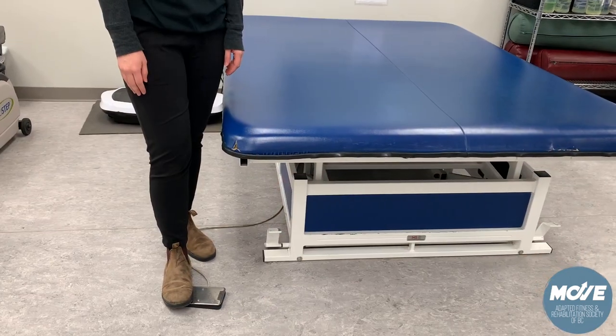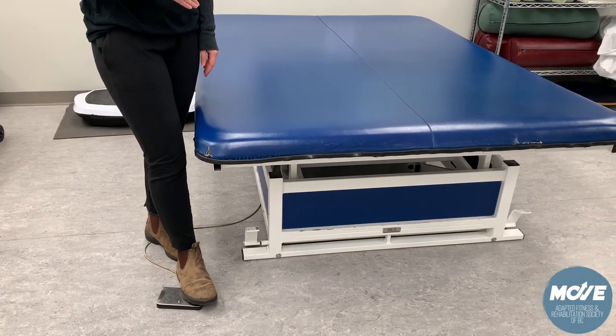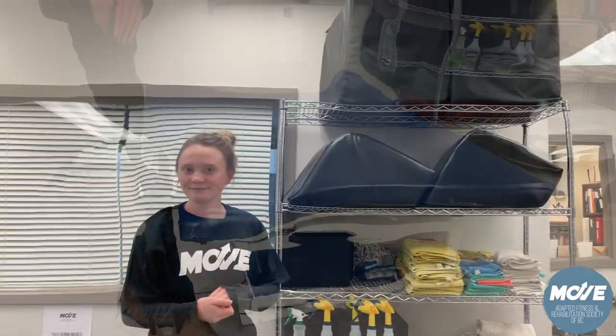The table height can be adjusted using a foot pedal attached to the side, and any extra equipment, pillows, or supports are located on the rack beside it.